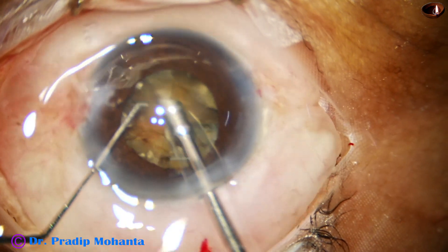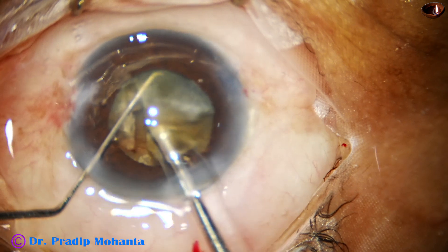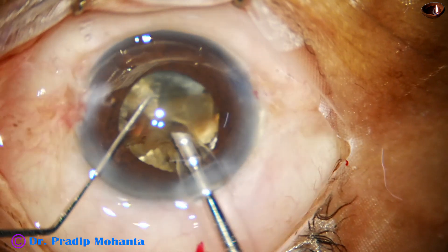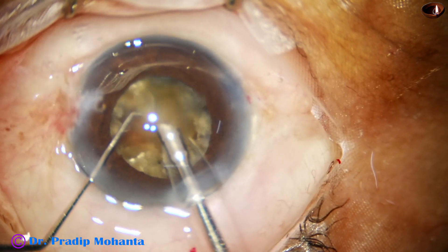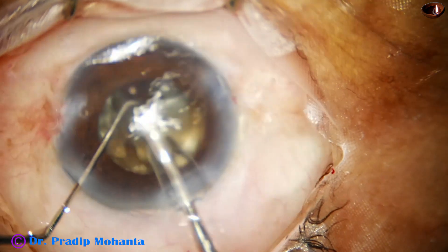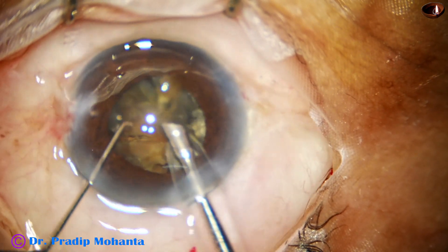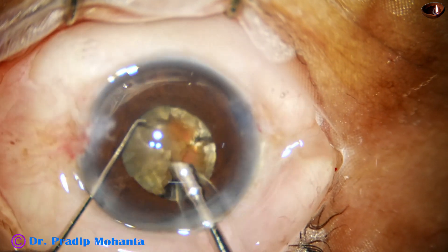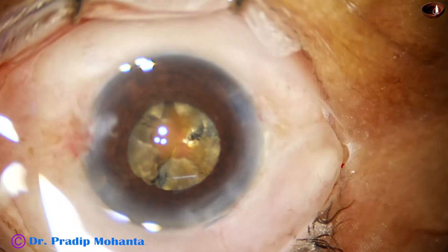This surgery took a long time — I spent 17 minutes to complete it. The surgery has been edited to 12 minutes. The ultrasonic energy used is about 90% in continuous mode. Flow rate is 48 ml per minute. Vacuum is 480 mmHg. Though the ultrasound is in continuous mode, I am using it very judiciously, intermittently.